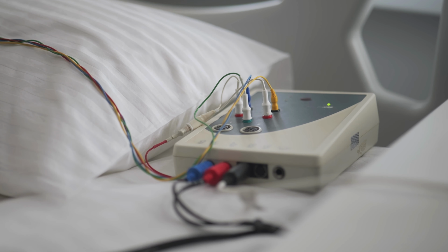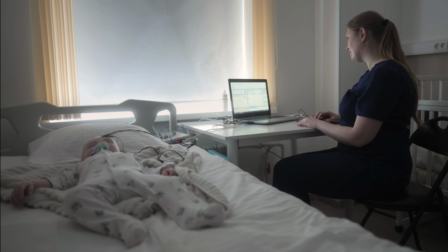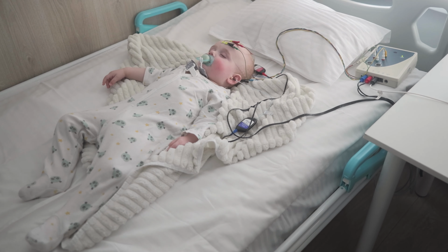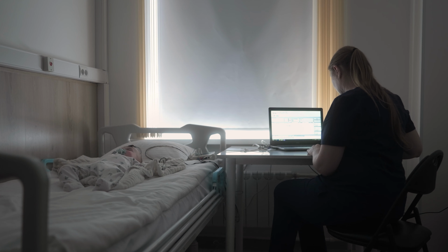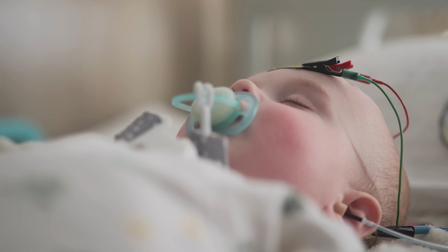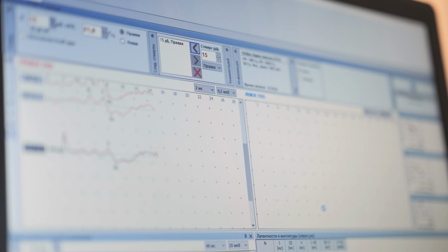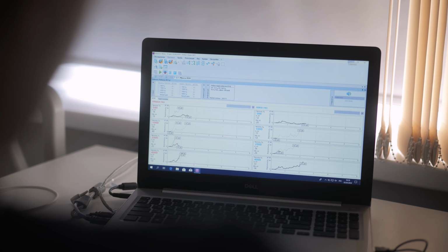The intensity of stimulation should be reduced smoothly. First, the second peak disappears, then the first and third ones. The fifth peak disappears last. Usually the second and fourth peaks are determined well only at suprathreshold intensities. The task of the examination is to determine the minimum stimulus intensity at which the fifth peak, the hearing threshold, is detected. If necessary, the next ASSR test can be performed after determining the threshold of the fifth ABR peak.